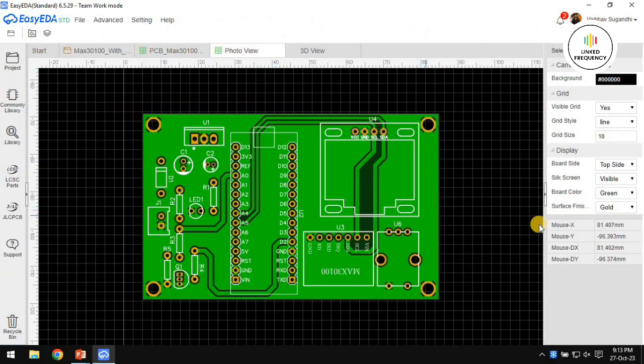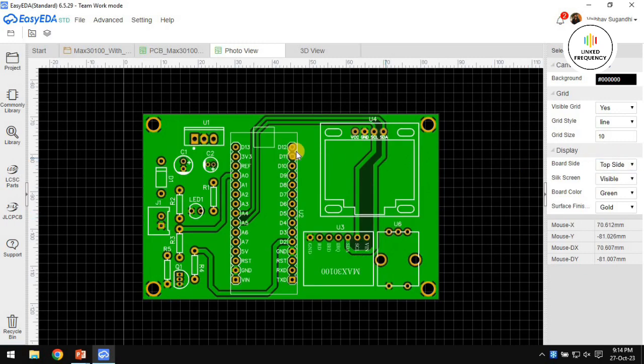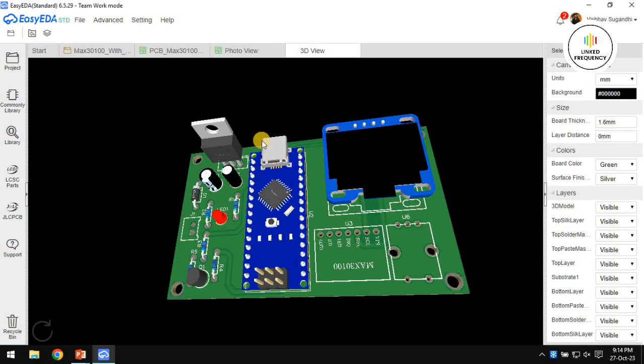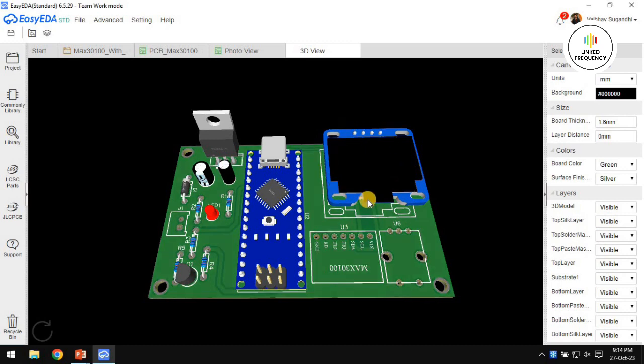And thereafter, we can go to the 2D diagram. This is how the PCB looks. Looks very wonderful to me. It's absolutely suitable to call it a hobby project, or a mini project, whatever you want to call it, for your academic year or at a personal hobby project level. And then if you go to the 3D model, this is how it looks. You can see the Arduino Nano USB cable is on the edge side or the border side so that you can program it at any point of time. And you can see the OLED here and the user interface here.